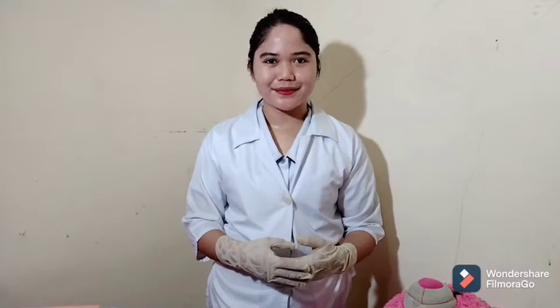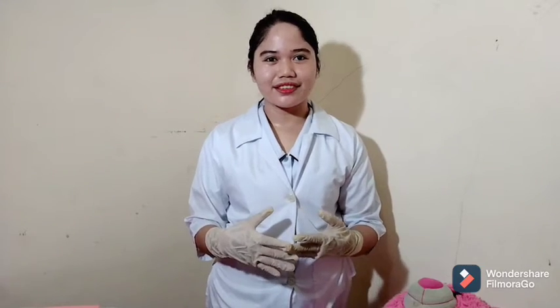Remove and clean the equipment. Make the client comfortable. Label the urine specimen and send to the laboratory promptly. Urine kept at room temperature may cause organisms, if present, to grow and distort laboratory findings. Wash your hands. Hand washing prevents the spread of microorganisms.